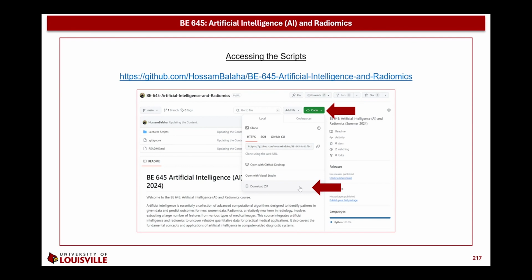And for the 3D volume, we dealt with a library called TriMesh that will convert any volume or any 3D matrix to a corresponding mesh. And this library also provides a set of features that can be accessed, as we saw. And finally, we saw how to visualize the mesh by converting the mesh to a scene, and that scene will be displayed using the show function.